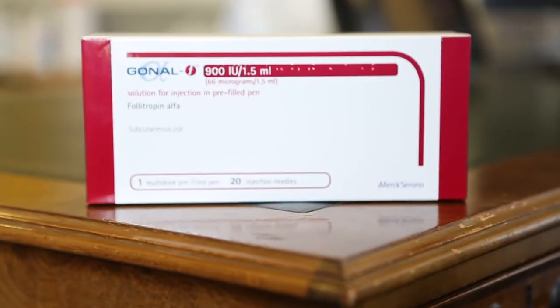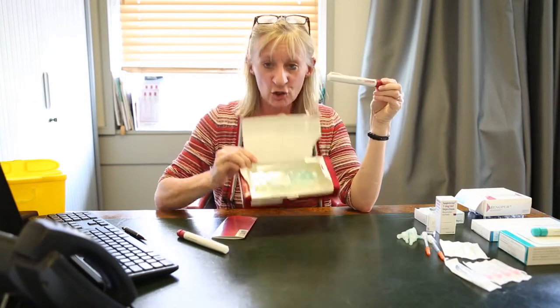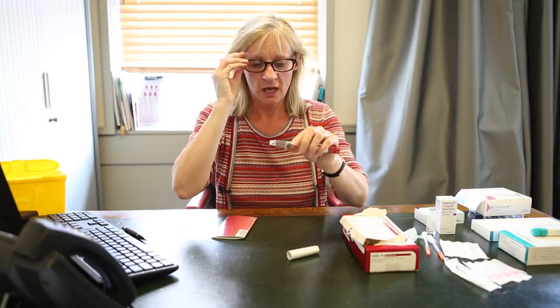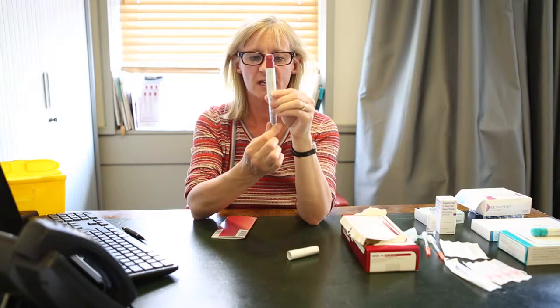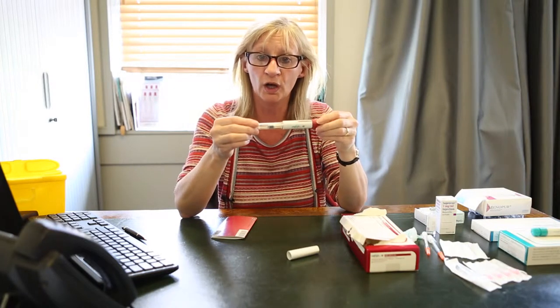I'm now going to show you how to use the drug Gonal F. You will receive a box or a number of boxes that look like this, and you will be asked to store these in the refrigerator. If you're going out for the evening, you can take it out with you in your bag and it will not damage the drug at all, but please do store the drugs in the fridge. In your box, you will have a pen and lots of needles. You will be told an exact dose — take the top off the pen and you will be able to see that your pen has a graduation down. Gonal F pens come in a variety of doses: this is a 900 IU pen, but it also comes as a 300 IU pen and a 450 IU pen. They all work exactly the same.